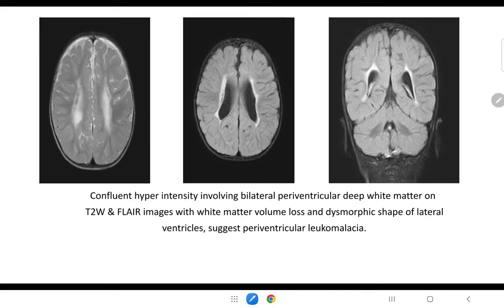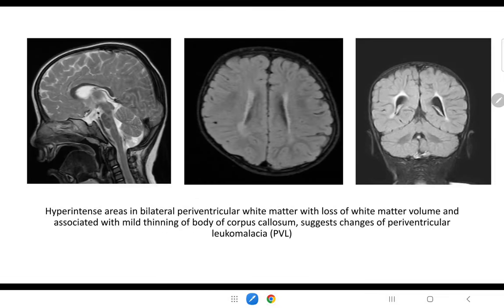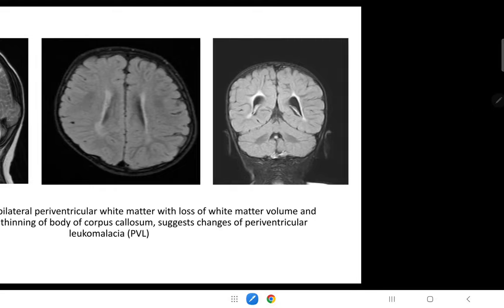T2 axial and FLAIR axial and coronal images show confluent hyperintensity involving bilateral periventricular deep white matter on T2 and FLAIR images, with white matter volume loss and dysmorphic shape of lateral ventricles, consistent with periventricular leukomalacia. T2 sagittal and FLAIR axial and coronal images show hyperintensity in bilateral periventricular white matter with loss of white matter volume and associated thinning of the body of the corpus callosum seen on the sagittal section, suggesting changes of periventricular leukomalacia.